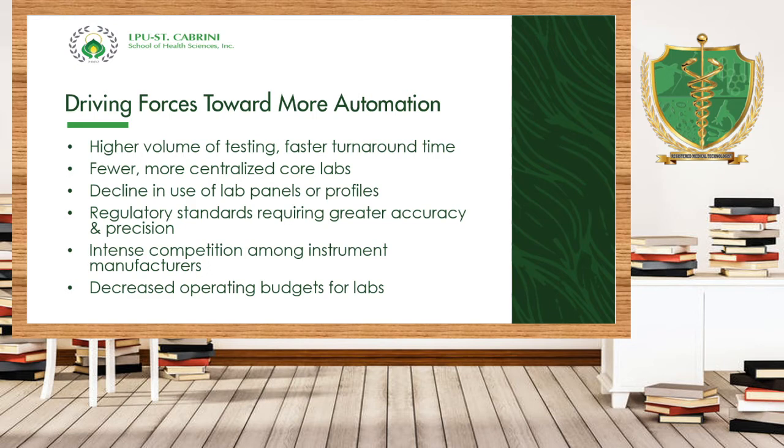Next is because of the regulatory standards requiring greater accuracy and precision. Di ba sabi ko sa inyo, we have what we call the National Quality Assurance Program or the National External Quality Assurance Scheme, which maintains the accuracy and the precision or the reliability of the results in the chemistry section, not only in the chemistry section, but in the whole laboratory.